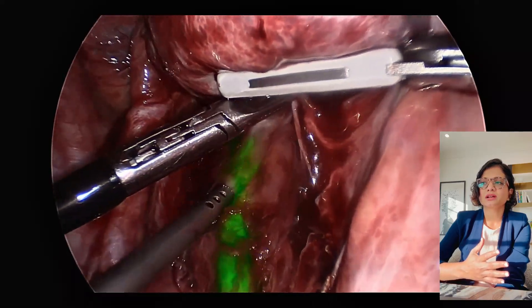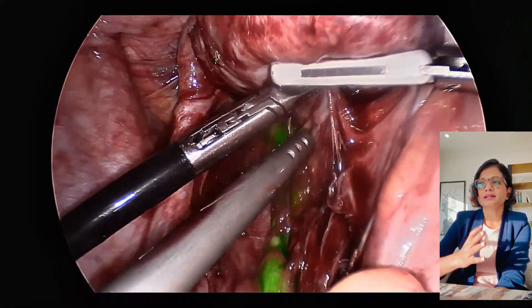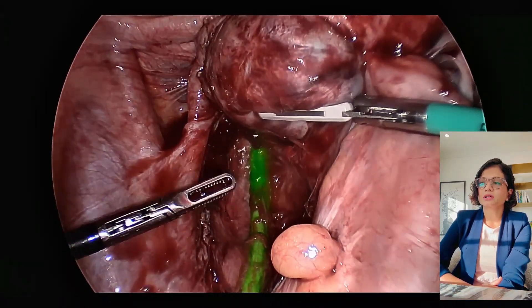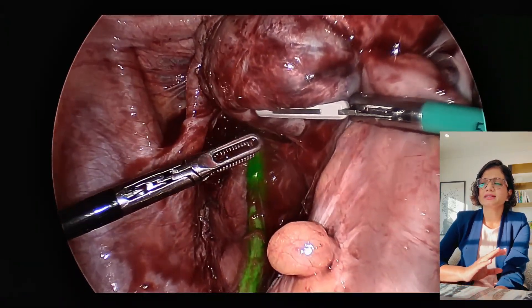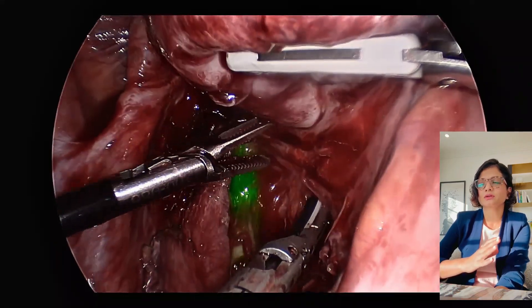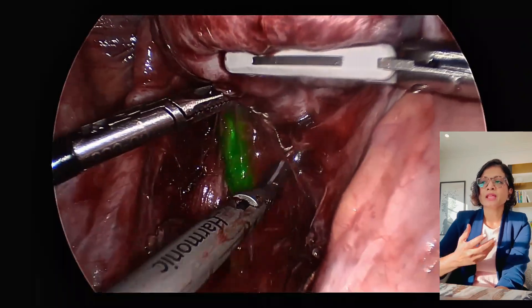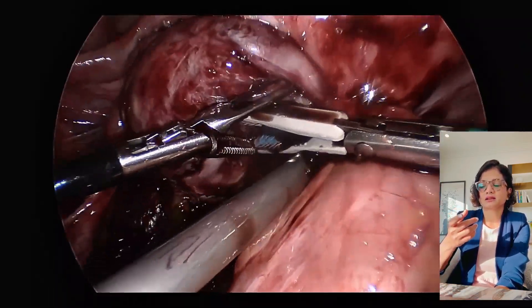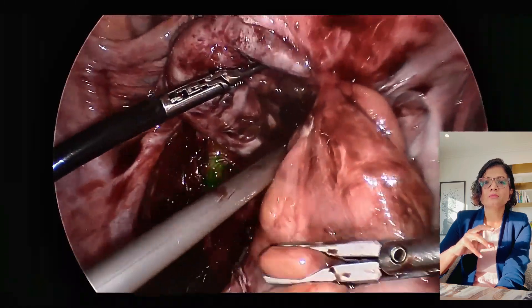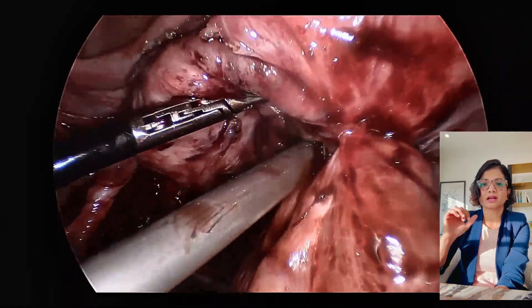The systems I've used — Striker, which I use quite often, Carlstose and Arthrex — I think all three are pretty good. So we've gone ahead and dissected the ureter over here because I don't follow set steps. Whatever the pelvis offers you is what we take. In this scenario, I thought it was very important to identify the ureter before figuring out where exactly I'm going to make my cut on the bowel.